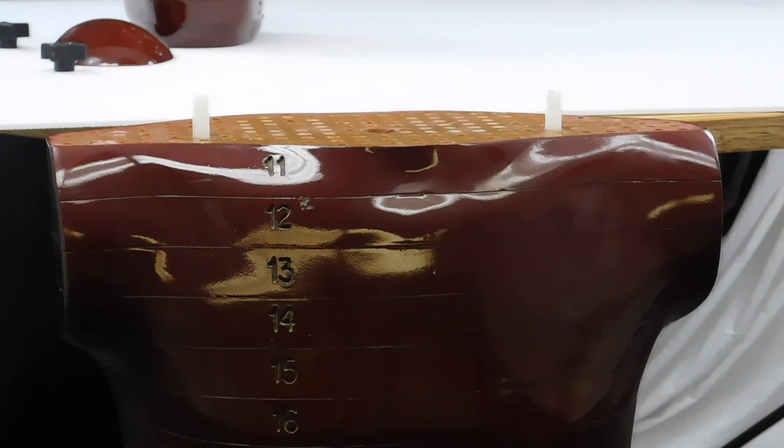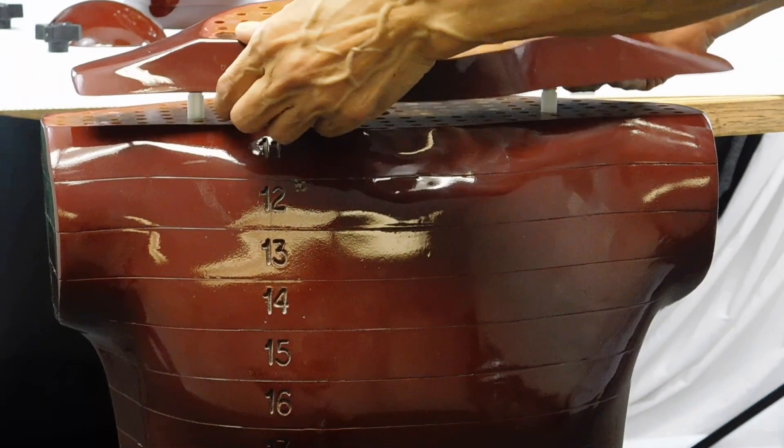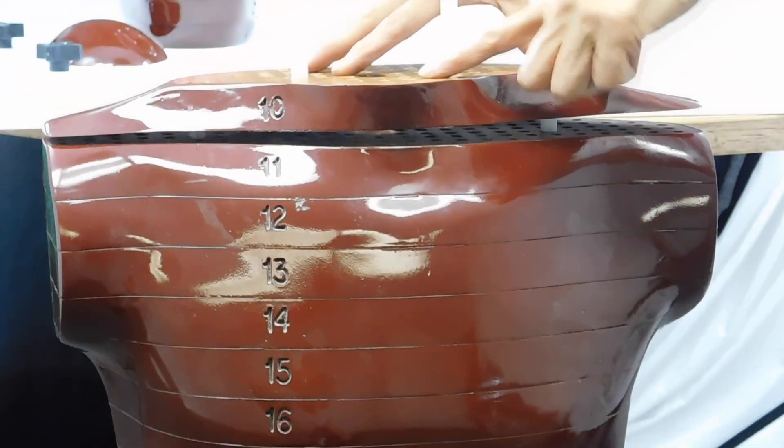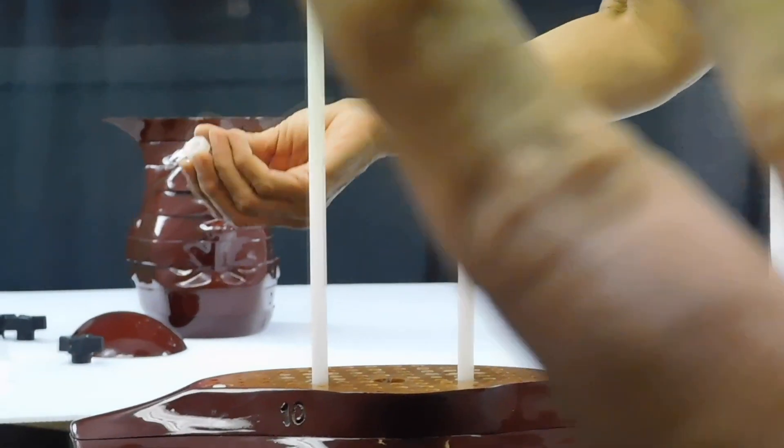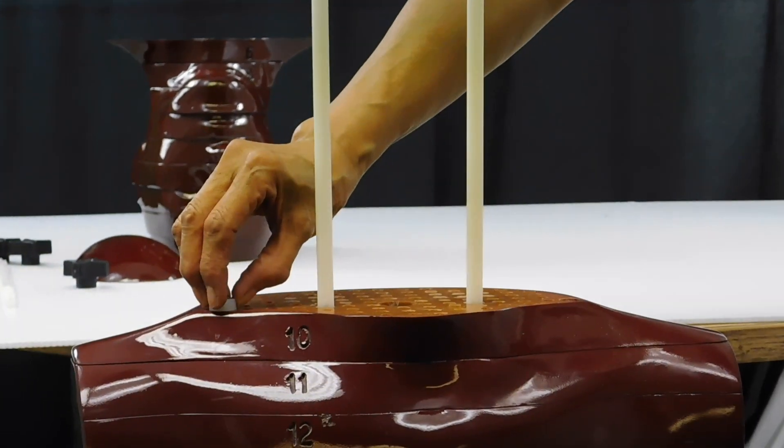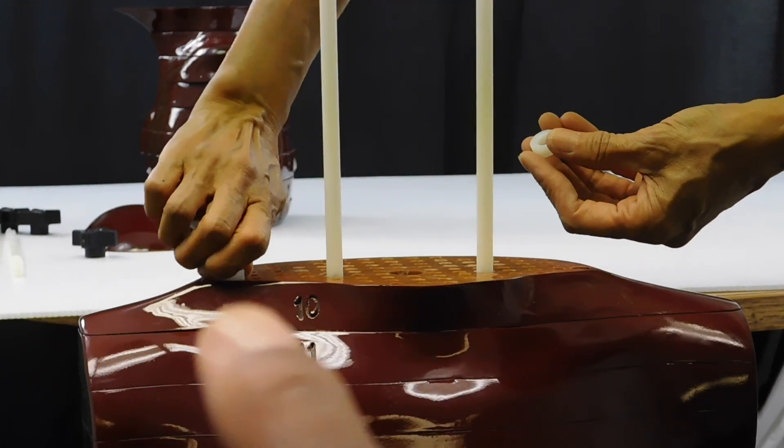For the next step, place section 10 on top and secure the original nylon rods with the hex nuts provided.